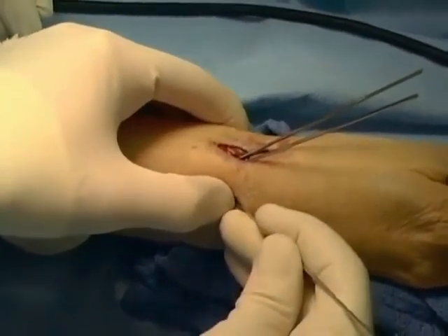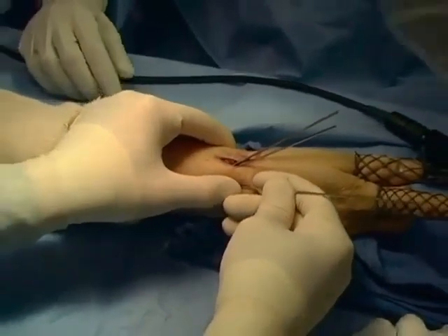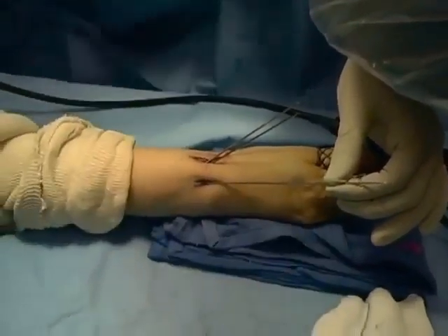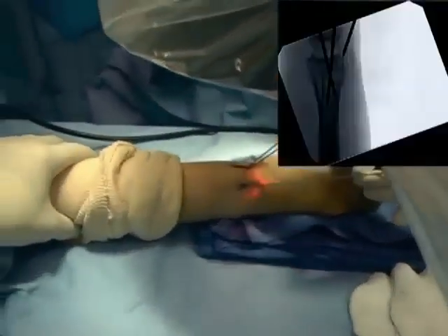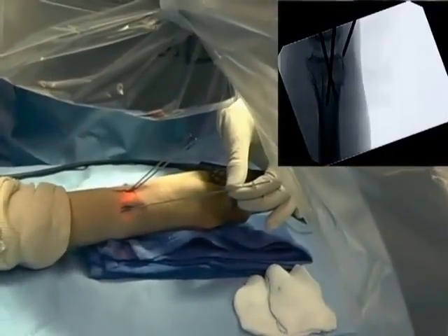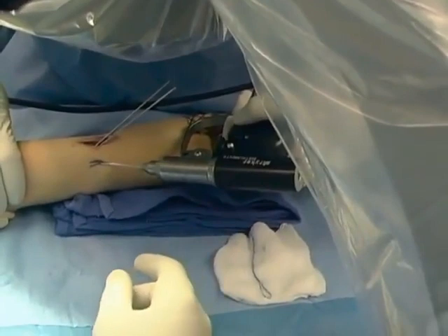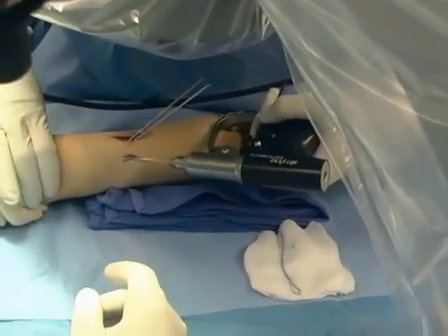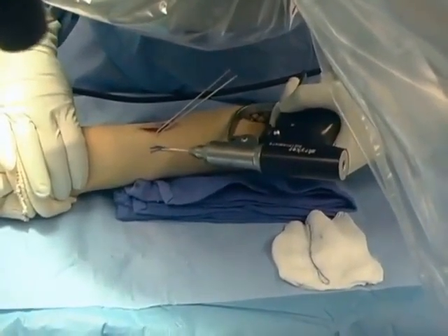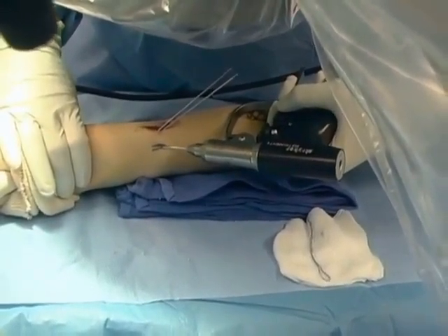In order to make the fracture as stable as possible, an orthogonal configuration of the pins is optimal. The third pin is placed in the dorsal rim of the distal radius just distal to Lister's tubercle, confirmed on the lateral view. Once the pin position is confirmed, the pin is driven from dorsal to volar across the fracture into the volar cortex of the distal radius proximal to the fracture line.